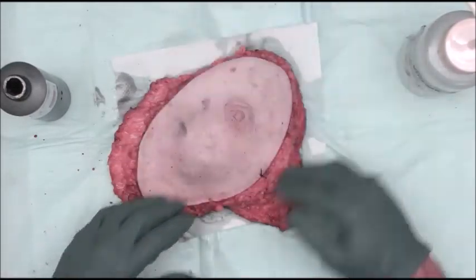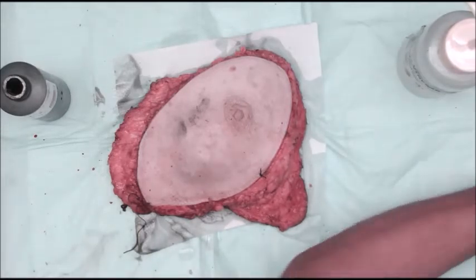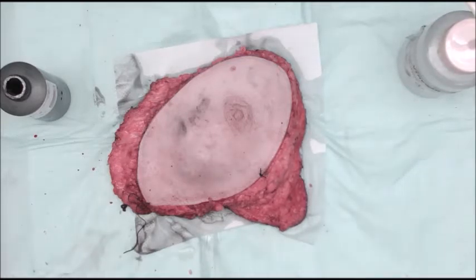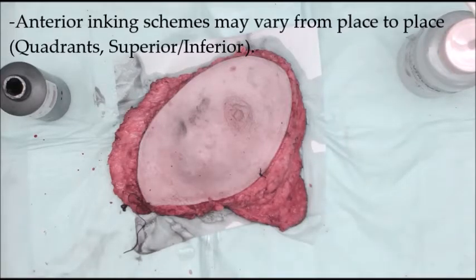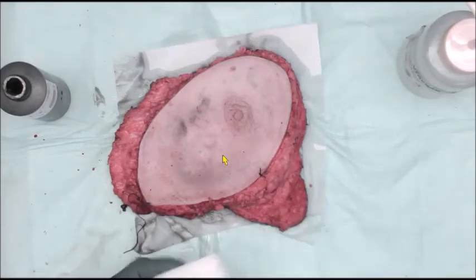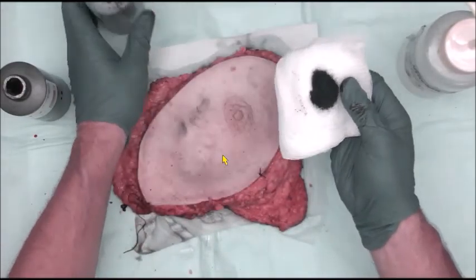So now we're going to ink the anterior aspect now with blue ink, and we do the same type of thing here. Some blue ink here.